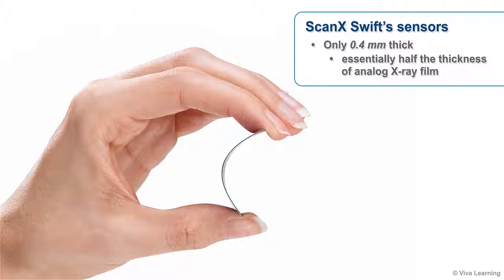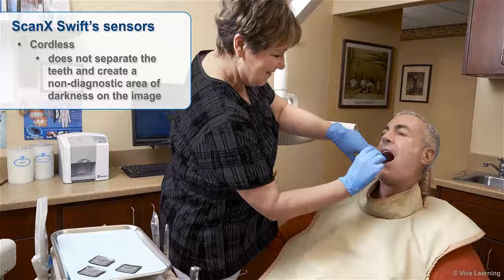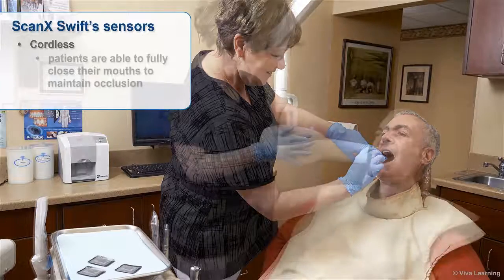In comparison, ScanX Swift sensors are only 0.4 mm thick, essentially half the thickness of analog x-ray film. In addition, the Swift sensors are cordless, so they don't separate the teeth and create a non-diagnostic area of darkness on the image the way that corded sensors do.